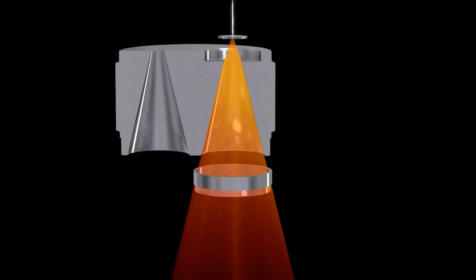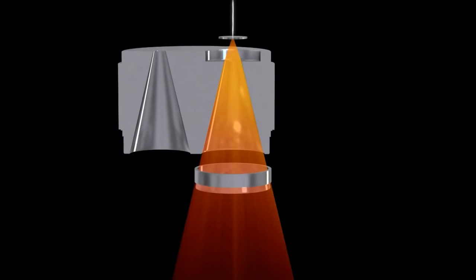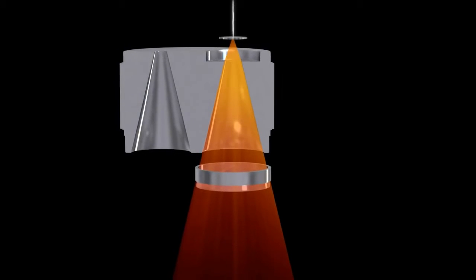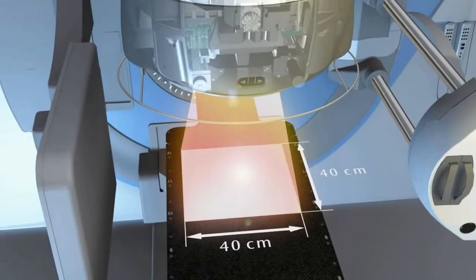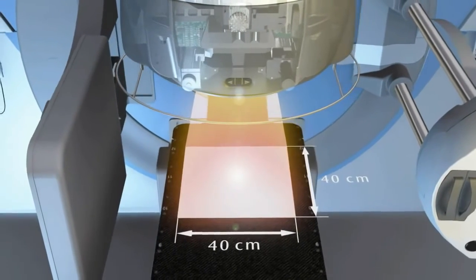The primary collimator minimizes leakage, and therefore excess total body dose, by absorbing scattered X-rays traveling in the lateral direction. It also defines the maximum size of the resulting clinical radiation beam.